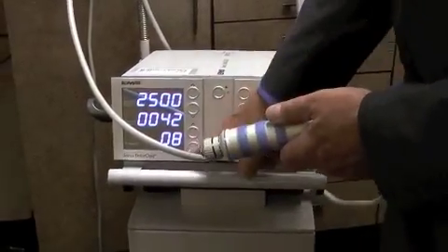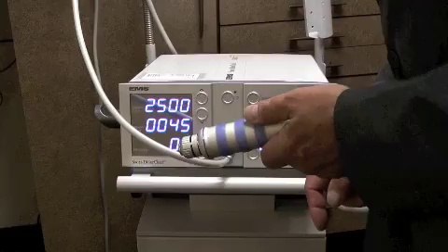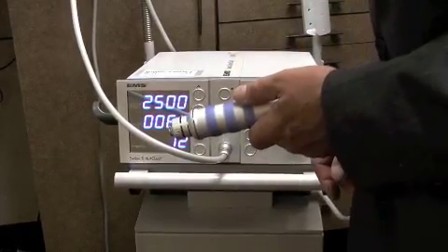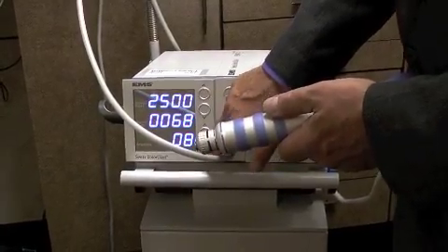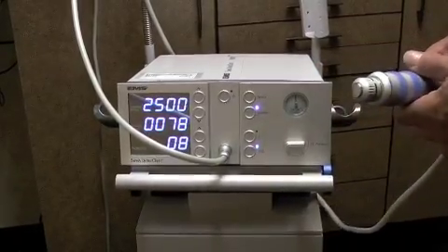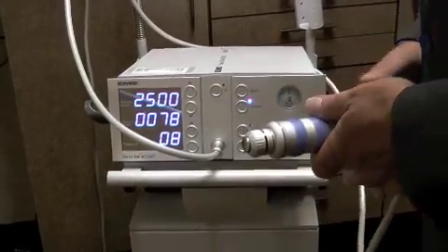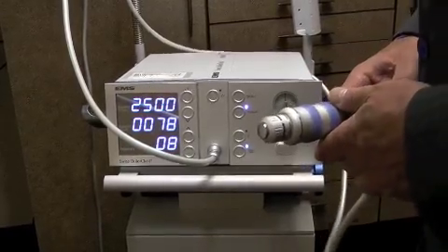So that's the frequency. If I turn that frequency down, you'll hear it go slower. I'll turn it up. Sounds a little bit like a machine gun. So we found the most effective to be about in the 8 or 9 category, but you can kind of play around with it. So the next thing we're going to look at is the power of the machine. What we usually find is it's best to start someone at about 2 bar with the arrow straight up and down and get them used to it.